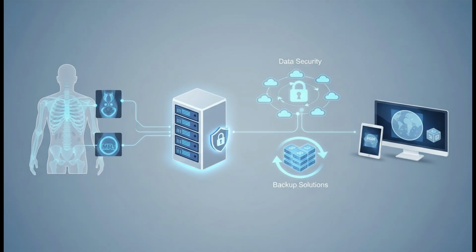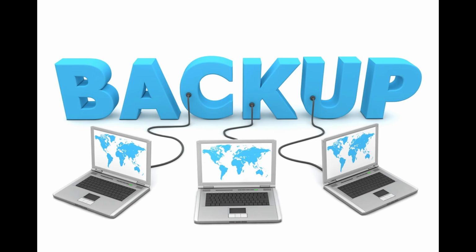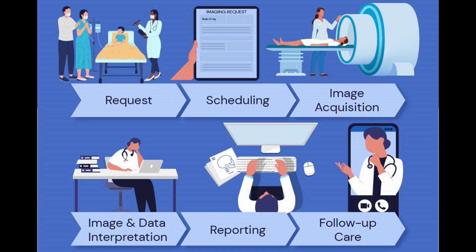Network infrastructure, servers, routers, and backup and redundancy policies are essential to prevent data loss and maintain information security. Without proper IT, even the best machines cannot effectively make images available to physicians. Without an IT system, the machine is practically ineffective, even if it has the best generator and tube in the world installed.